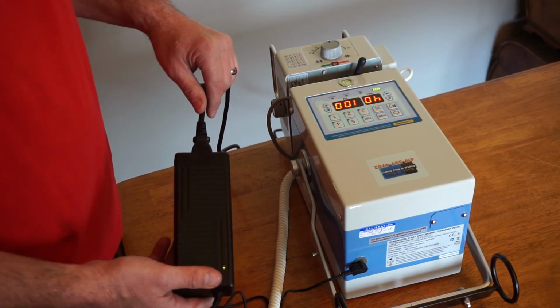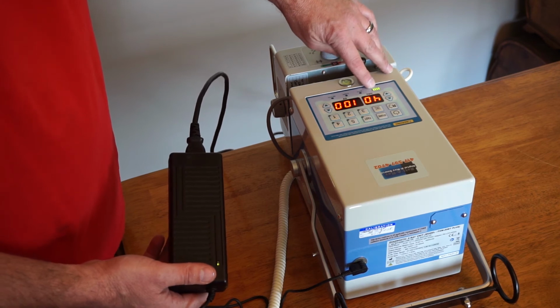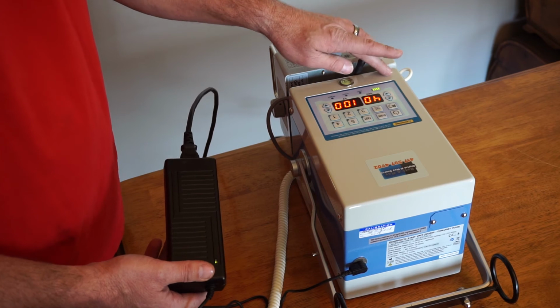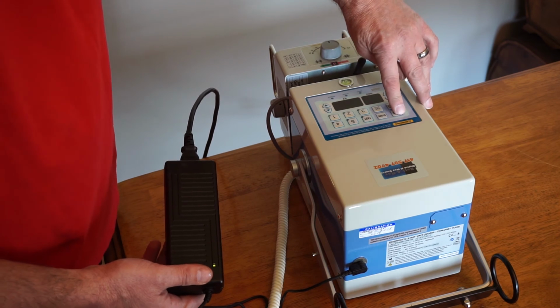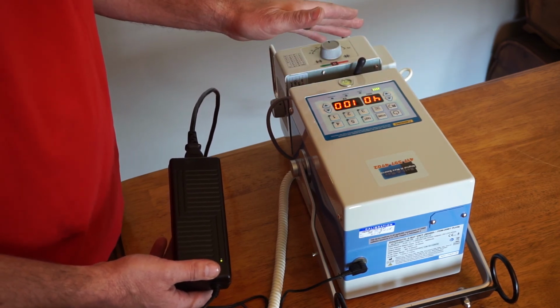You can also check the battery life with the indicator here. When this fifth bar is illuminated, you're fully charged. You can also check by turning the machine off, and when you turn it on, in the kV readout it will say the percentage. That is at, what's that, 98?